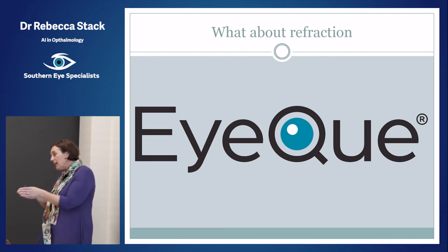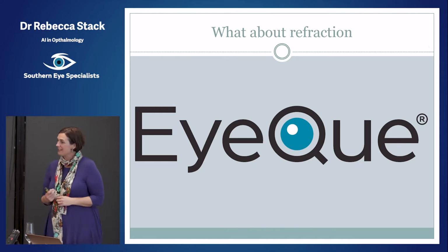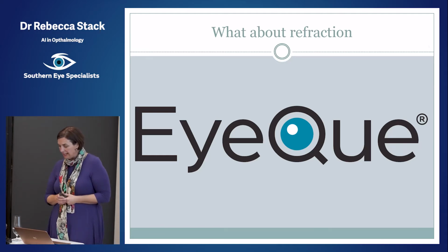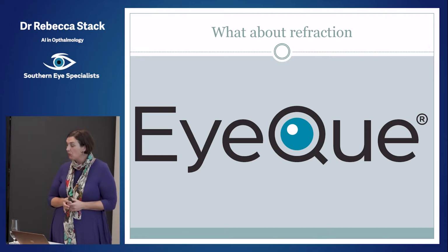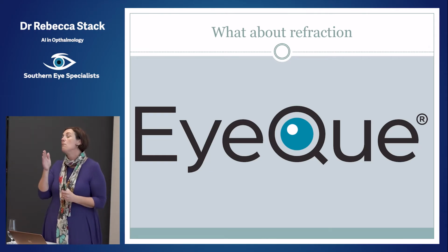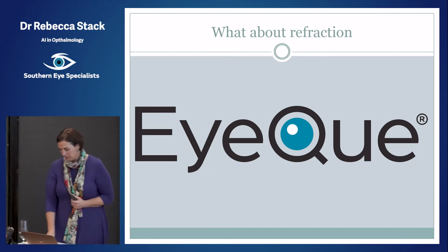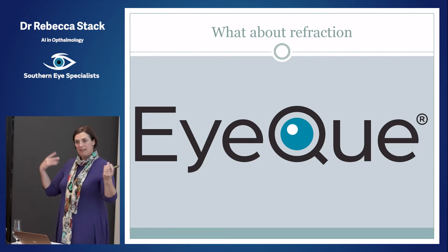And then, of course, it feeds you off down the line to the place where you can get your glasses and send you out these glasses. So you use it with a smartphone. You buy this personal vision tracker, and at the time that it was available in the States, for a couple of years online, it was $45 to buy this tracker, and then you could do 3 tests. Well, you had to do a minimum of 3 tests that were within a certain level of tolerance for the computer to accept that that was an accurate refraction. And then you'd link it up with a spectacle dispenser, and they'd send you out your glasses.